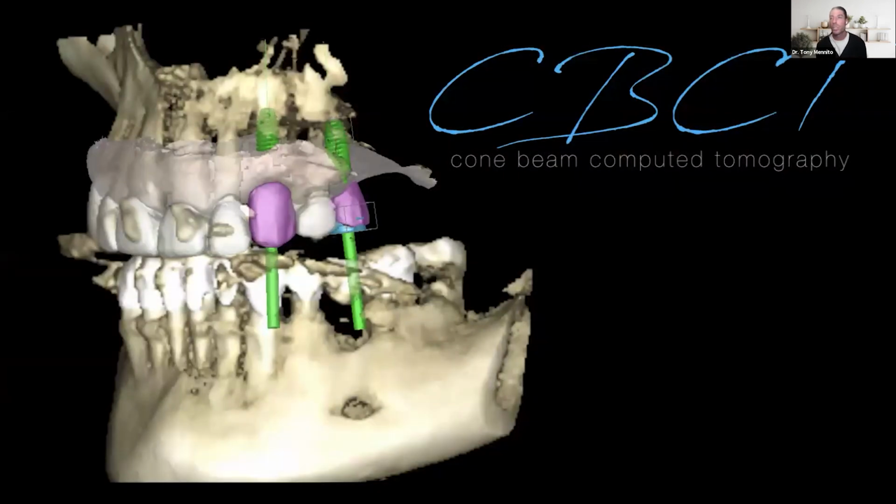So, just a little bit on intraoral scanning. Like I said, it is an incredibly valuable thing. As we go through the rest of this presentation, I'll talk a little bit more about how we use those intraoral scans, but every single new patient gets an intraoral scan, and I always have a reason to use that scan, no matter what we're doing with the patient.